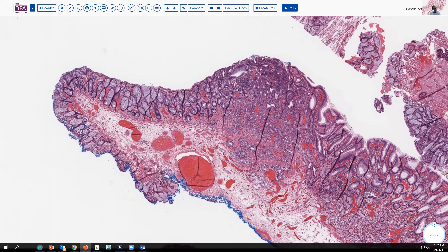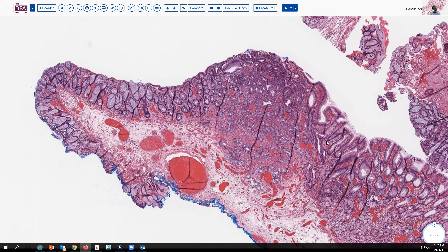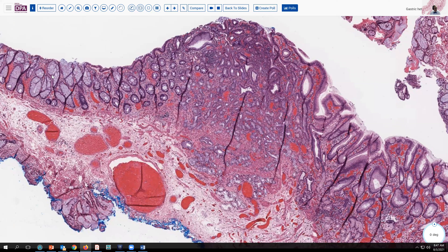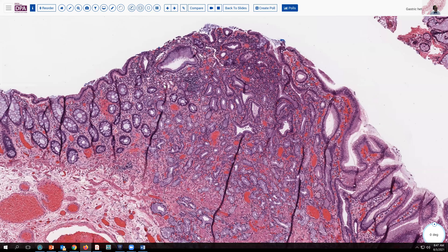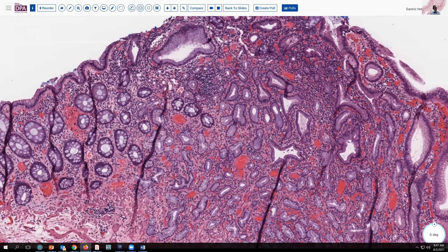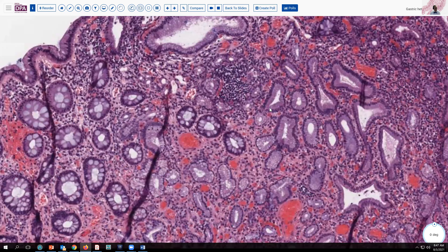If you've looked closely, you'll notice that the surface epithelium here to the right is different from our normal goblet cell-rich type of mucosa on the left. We can see that we lose the goblet cells and we have more of a foveal-type epithelium here, comparing these glands to these. This looks much more like a foveal-type epithelium.